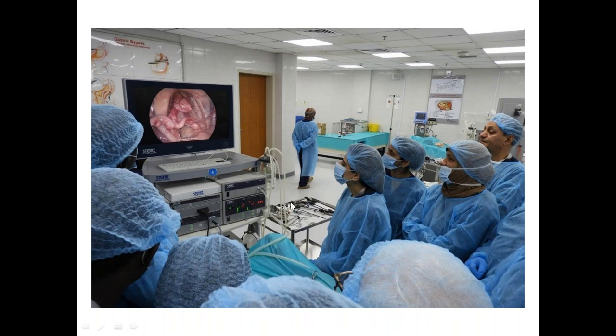A lot of people are watching, but a lot of cost is involved in all these gadgets. You need an additional biomedical technician who can take care of these things, because the surgeon is not going to be going and touching and even setting things. After all, these are electronic things. Because you're relying on electronic things, it's just like at your home sometimes, when you're working with the washing machine, it suddenly conks off. Now your work has stopped.